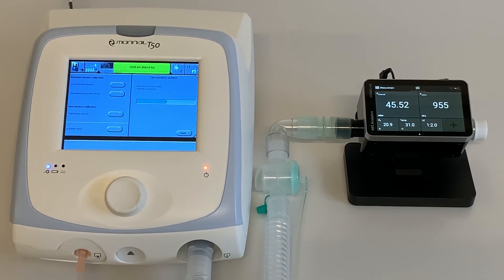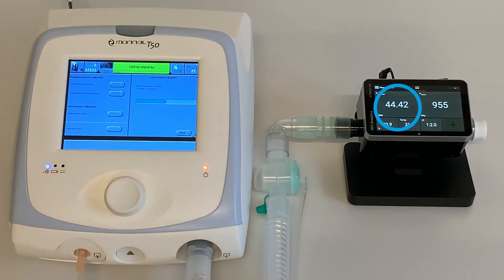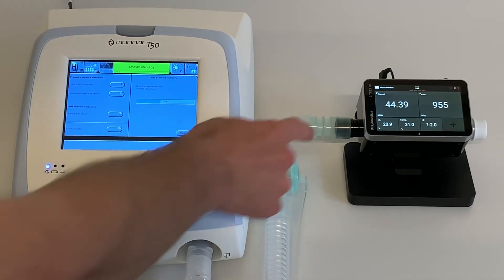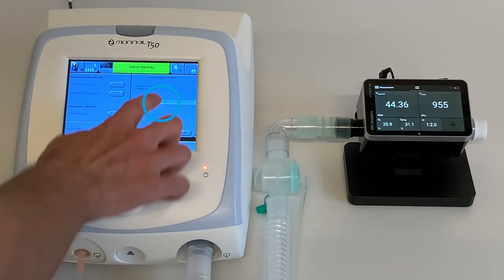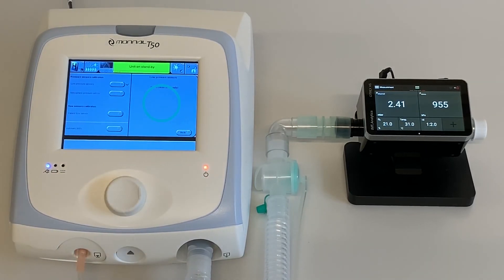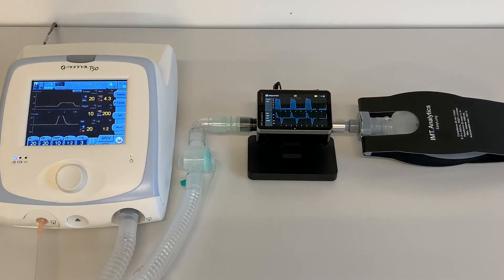Wait until the pressure stabilizes. When the value on the Citrex H5 is stable, you can set the value on the Monal T50 Ventilator. In our case, the Citrex reads 44.3, so select 44 on the Monal T50 by turning the control knob to the correct value. Press the control knob to save the setting. When the test is successfully completed, the Monal T50 Ventilator is ready to use.